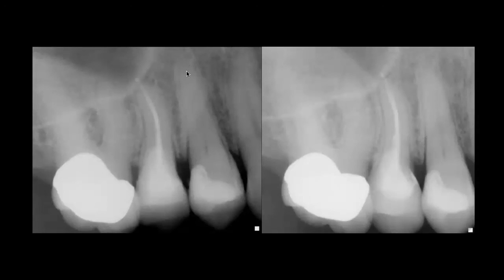But I want you to take a look at the tooth on the right hand side. I also restored this tooth with a biomimetic approach using just direct resin composite. And you can see this line right here because in this particular case, I placed my polyethylene fiber on the axial wall.